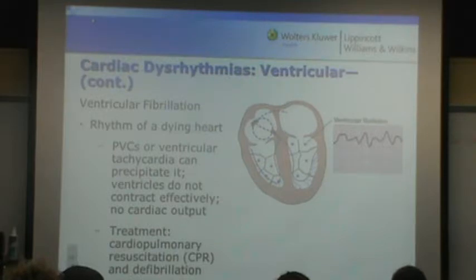This is one of those that when you were going through CPR and you talked about making sure we defibrillated the patient as quickly as possible, as soon as an AED or defibrillator was available, this is one of the rhythms that we were talking about.